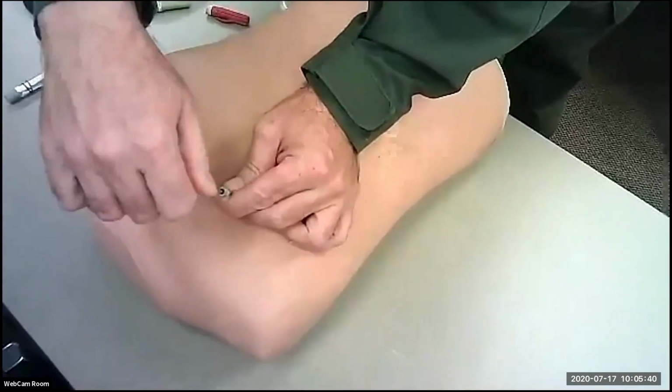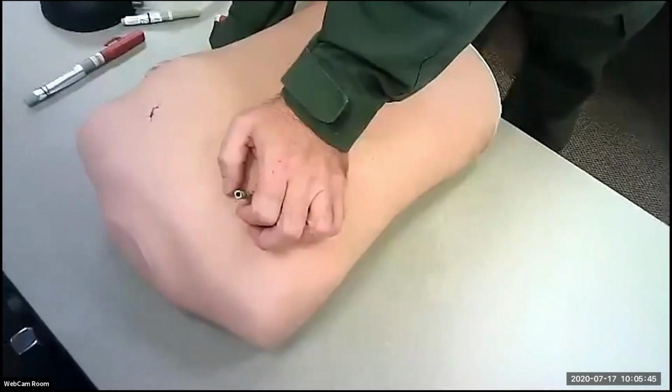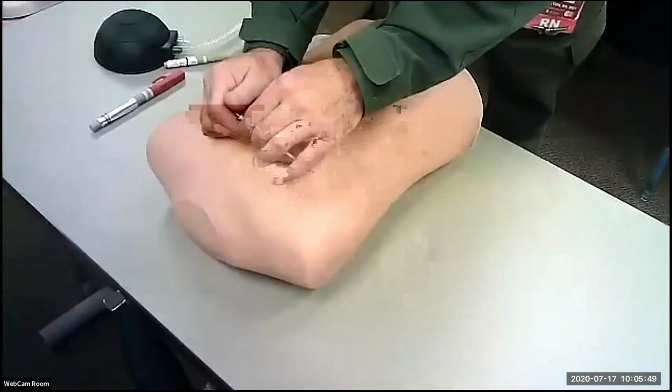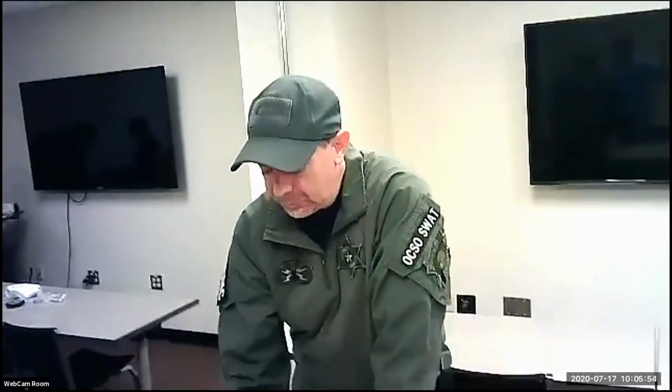Go down in, or needle out, and bury the hub. Okay, and the video you're about to see will demonstrate that a little bit better. These will often clot up, okay? There are several different methods. You can use a syringe and burp a little bit of air through it. Don't push fluid in there, just burp it. Sometimes that'll remove the clot. Oftentimes you just need to put another needle in. Like I said, there are pictures with many, many needles in people's chests trying to do that.